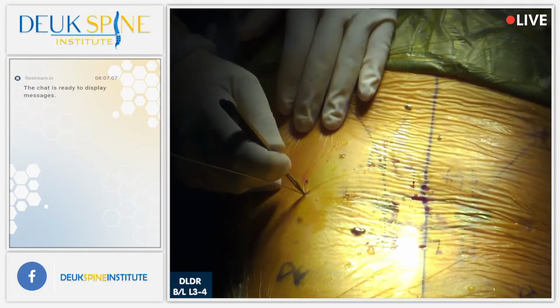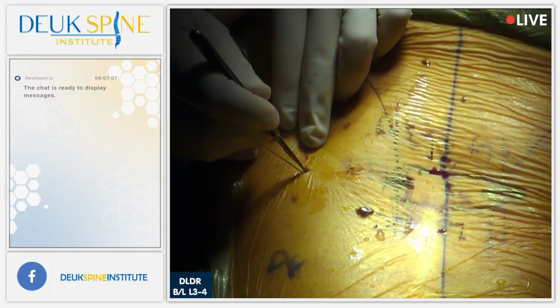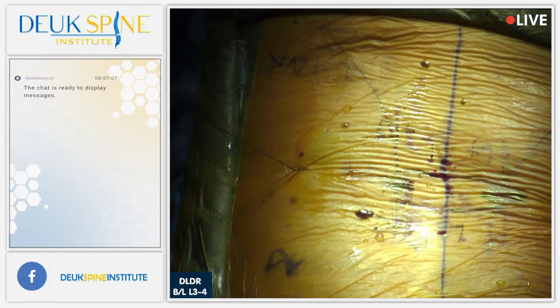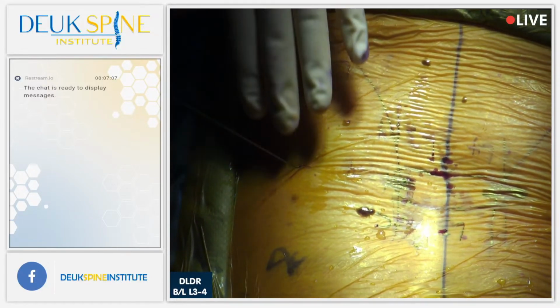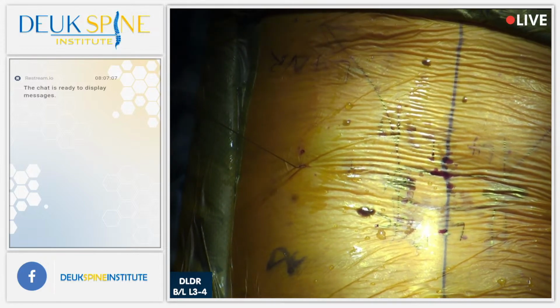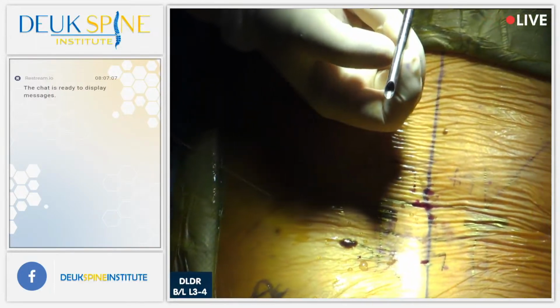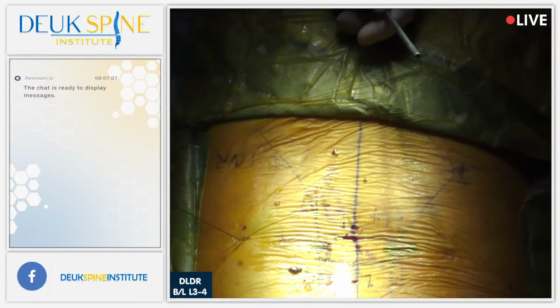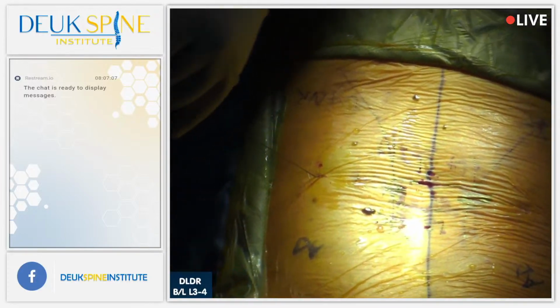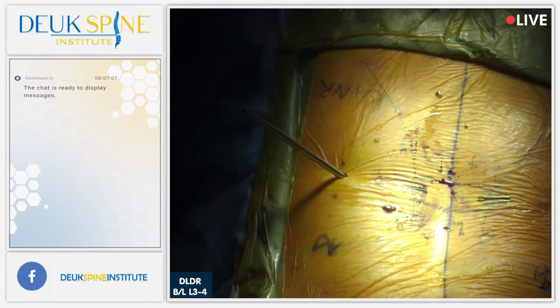And anyway, you just got to be careful. Okay, 7mm incision, again. This is a Band-Aid incision, tiny, tiny. And the reason why the incision's 7mm is because the outer diameter of the tube I use, this endoscopic tube, is 7mm wide. So that's all we need. We don't need a wider tube. We don't need a wider incision. You can do everything through that tiny incision.